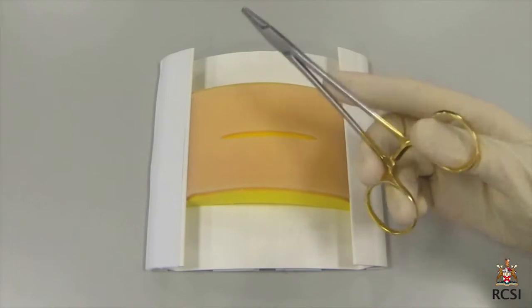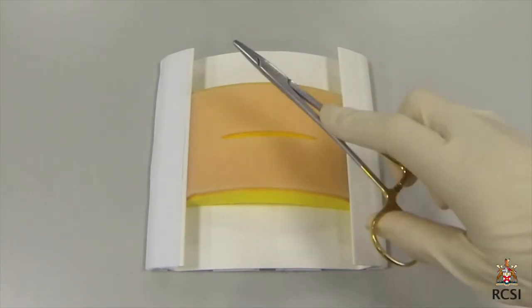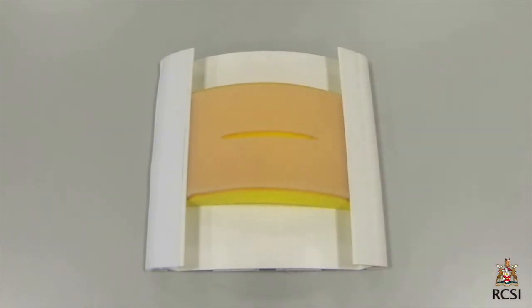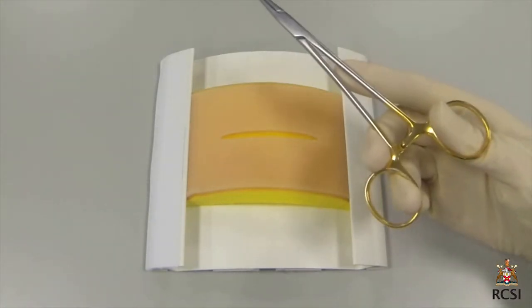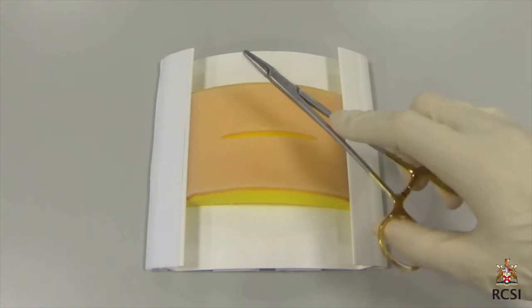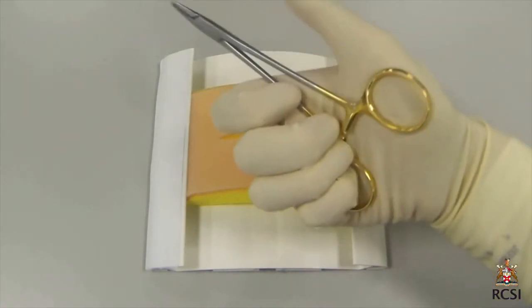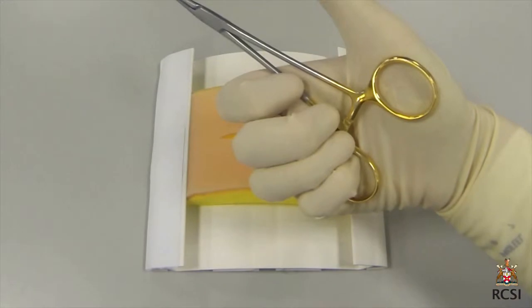The instruments used are the Atson toothed forceps, which is held like a pencil, and a needle holder which is held with the tips of the thumb and ring finger and supported along the shaft by the index finger. The ratchet is opened and closed when picking up the needle. There are different sized needle holders depending on the size of the needle to be used.